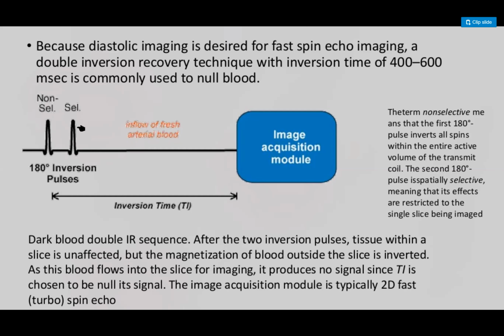What it's doing is making a wave come out of the protons that will give information much better than just one pulse. Because every time you give a pulse, the protons align, and you want them to focus along one axis, because you can only get information in one axis. If they keep on becoming haphazard, then you don't get a good signal. So you align them at 90 degrees, and then you invert them at 180 degrees. So every time they give you double information, and then you use it to make the image.